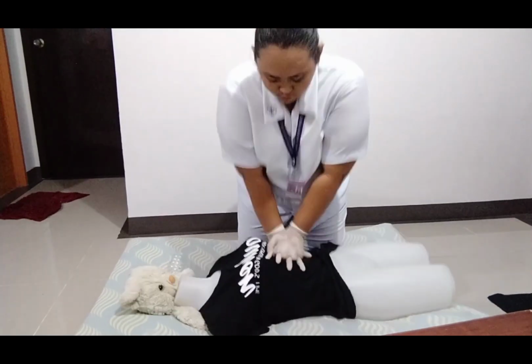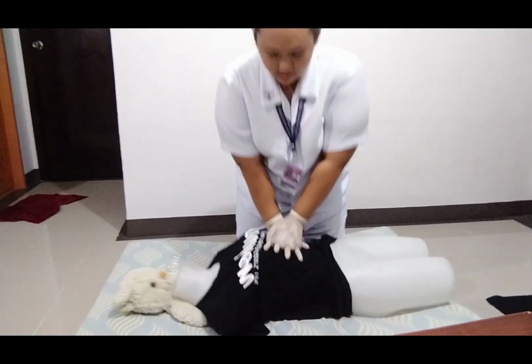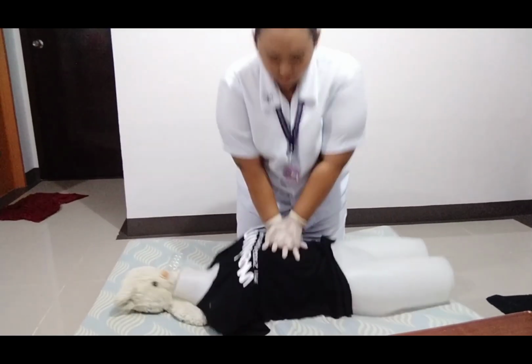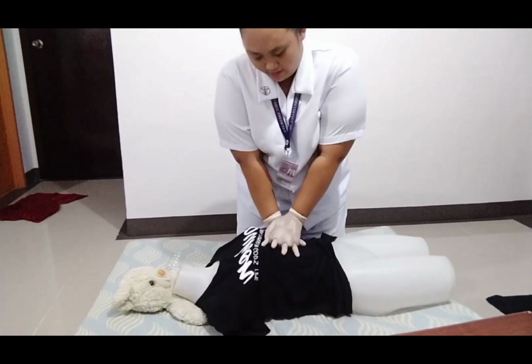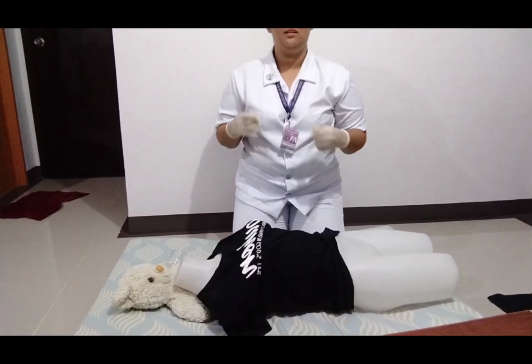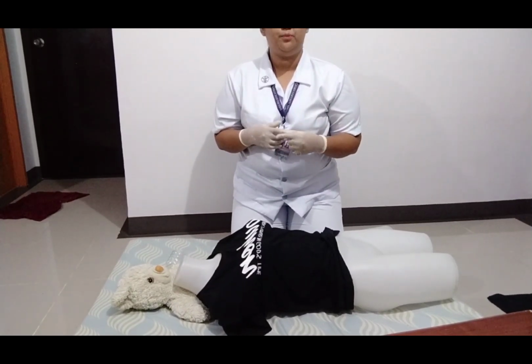1, 2, 3, 4, 5, 6, 7, 8, 9, 10, 11, 12, 13, 14, 15, 16, 17, 18, 19, 20, 21, 22, 23, 24, 25, 26, 27, 28, 29, 30. Now ensure that there is a complete chest recoil for each compression.